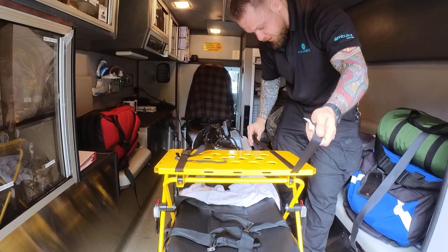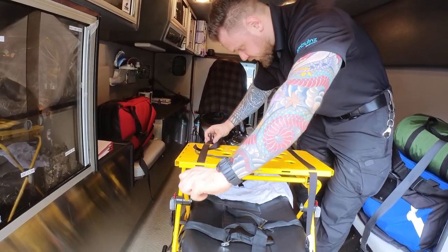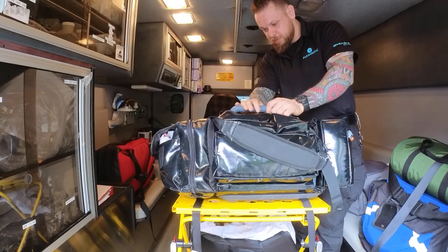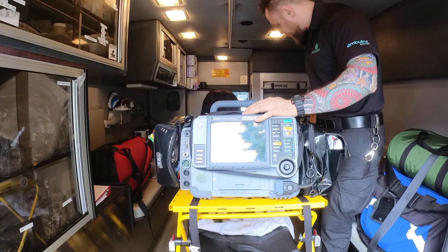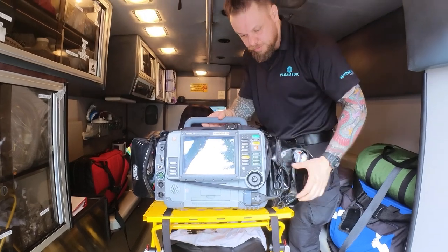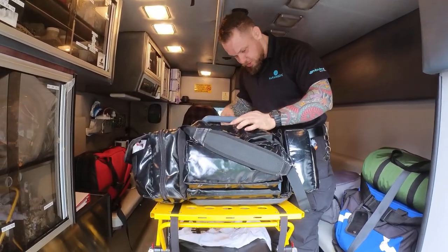Now I'll show you how to mount the LifePack 15. I open these straps up. I have the monitor facing toward the side where I'll be sitting — not facing away — because I'm going to be sitting by the patient's side and I want to see the readouts. If you put it facing away you won't have a clean readout. This is how the monitor will be housed and I run the straps under.